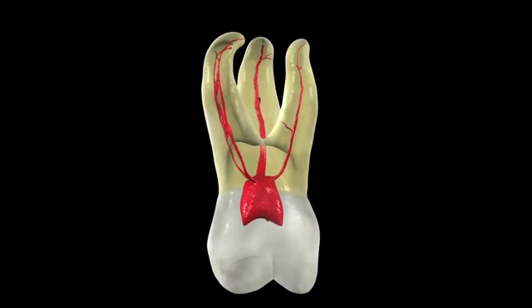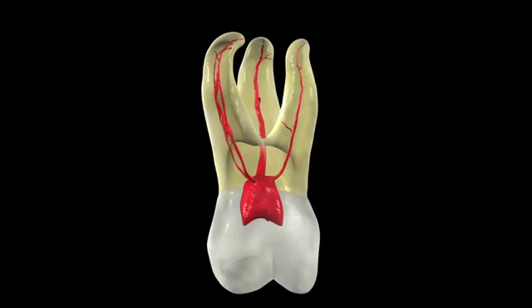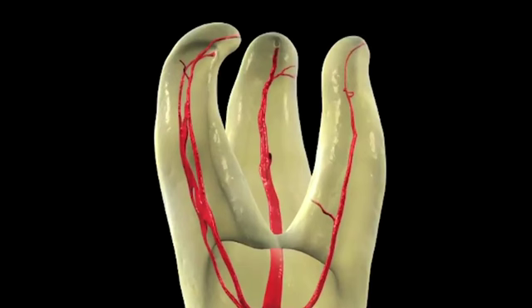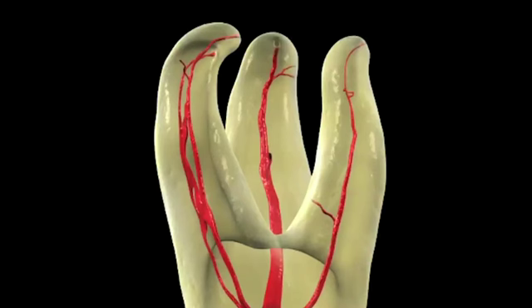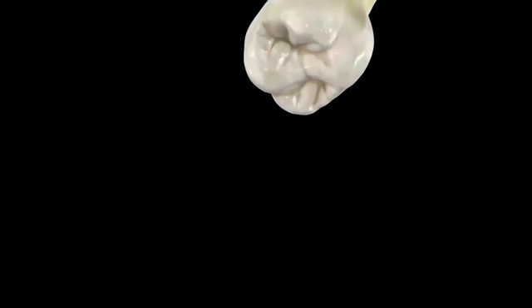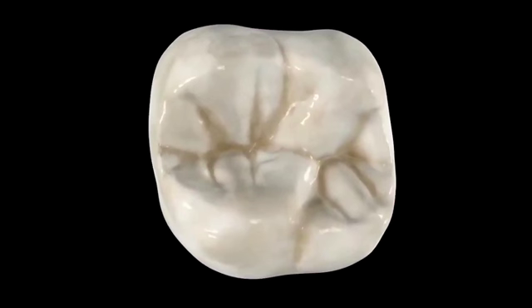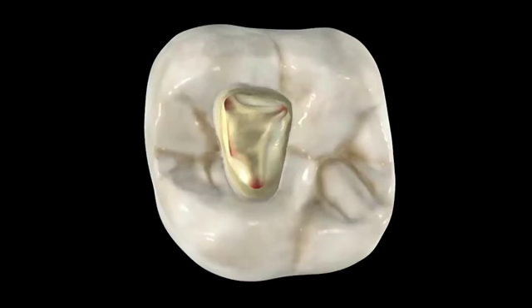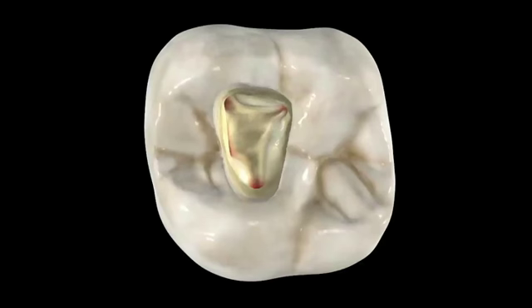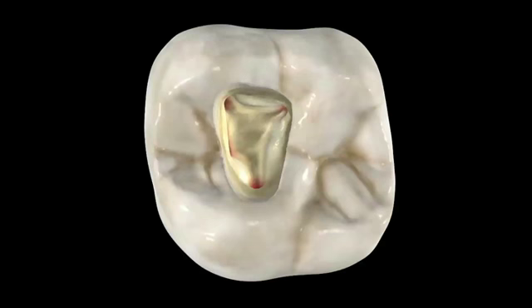Today's assignment focuses on the distal buccal. The distal buccal root is deceptively simple when looking at the root itself, but zooming in on the system moving through that root reveals multiplanar curvature. The canal makes an abrupt recurvature towards the distal, and the portal of exit is on the distal aspect of the distal buccal root. When you look down on this tooth, you can see where to cut your outline pattern, because access is everything in good endodontics. The access pattern should include the orifices.